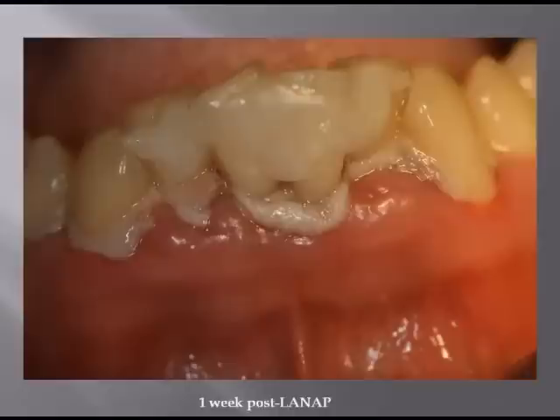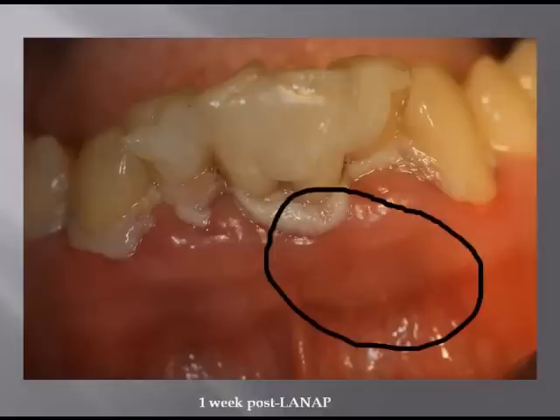This is what he looked like one week later. What you're looking at here, this white area right here — this is our fibrin clot. This is what the clot, that biological bandage I showed you at the beginning, looks like at approximately a week. We know he hasn't brushed, but this is showing the integrity and how long this biological seal lasts.